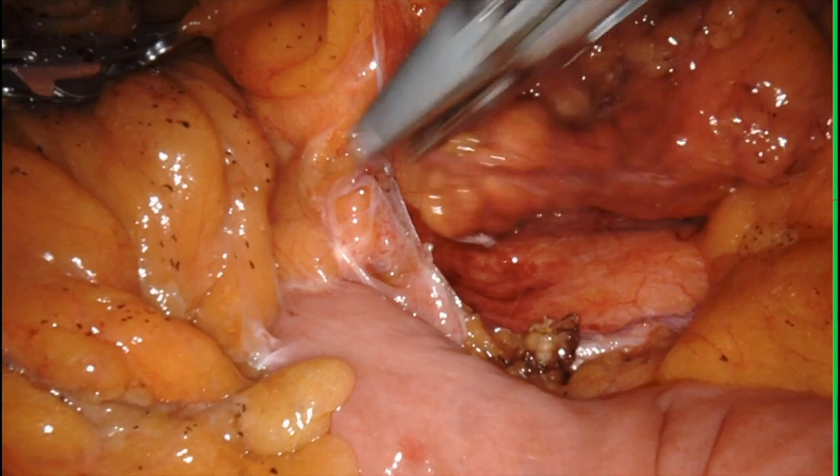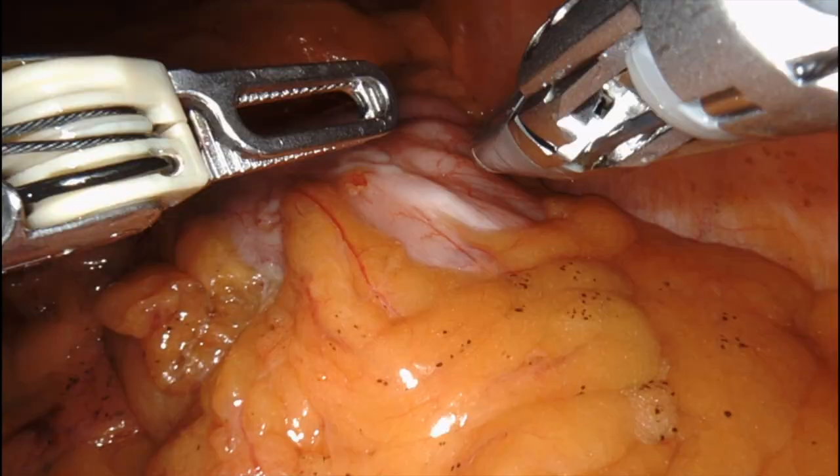There you see me taking the pedicle, and now I go taking the mesocolon until I see the body of the pancreas, where I want to stop my dissection.